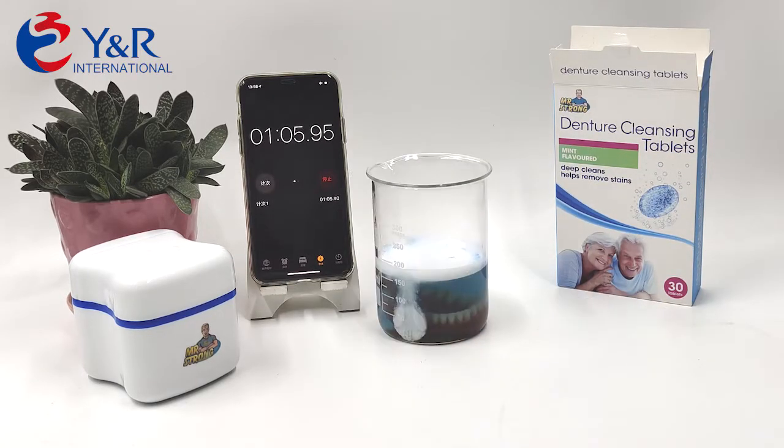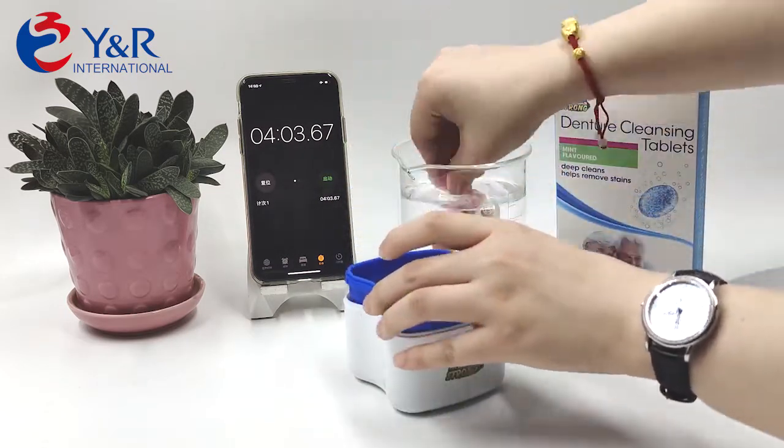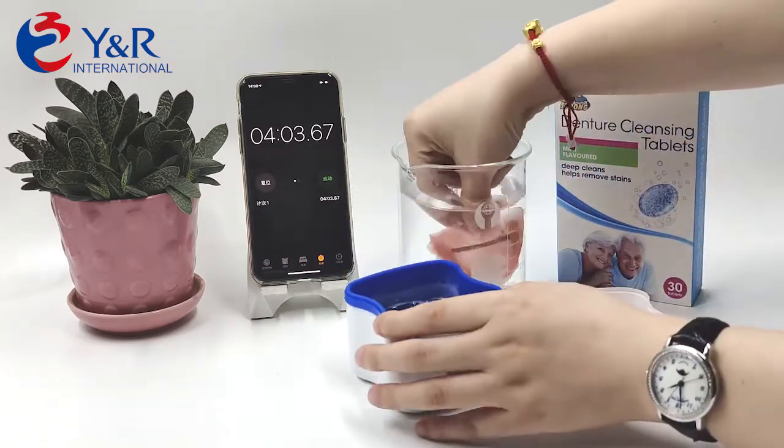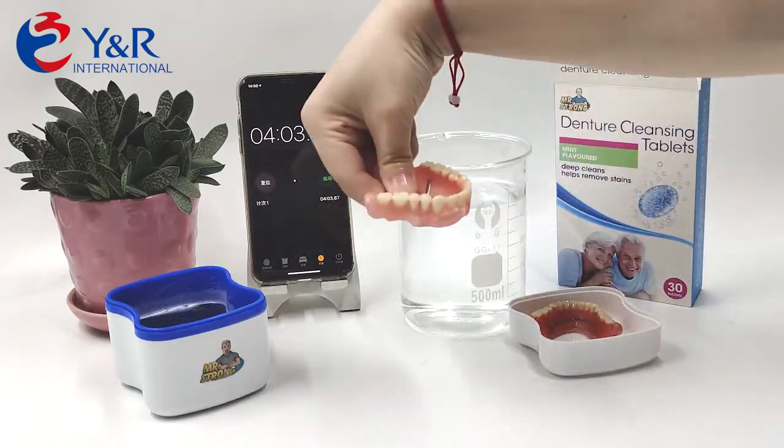The two-layers design brings it stronger power, fast dissolved in three minutes. Finish cleaning and kill 99.9% bacteria in 15 minutes. Then simply rinse the denture in clean water. It will be clean and fresh again.